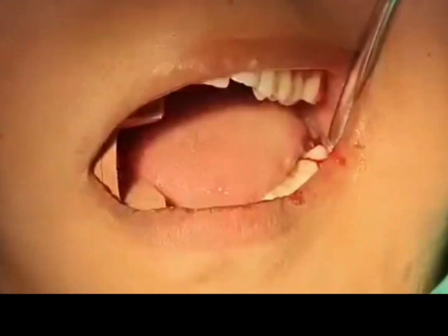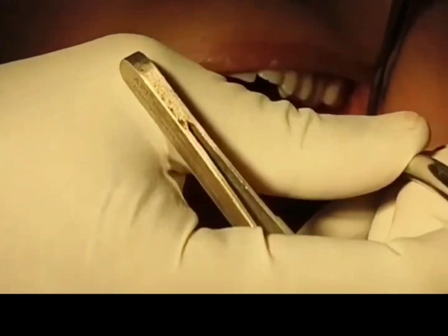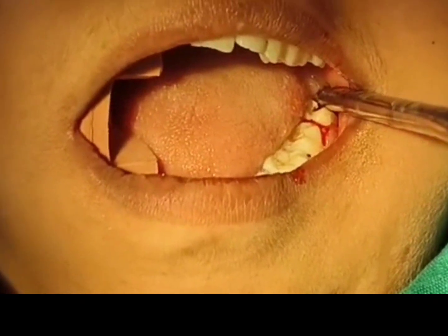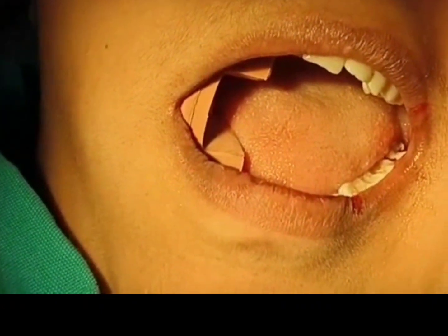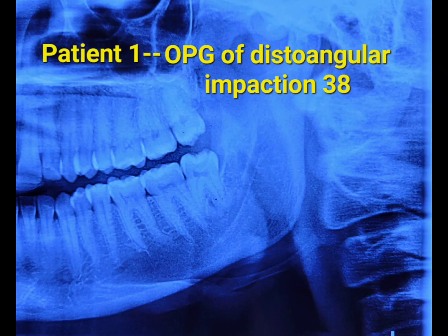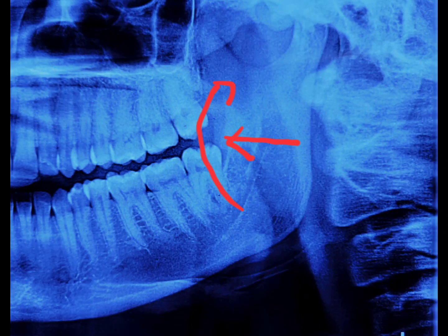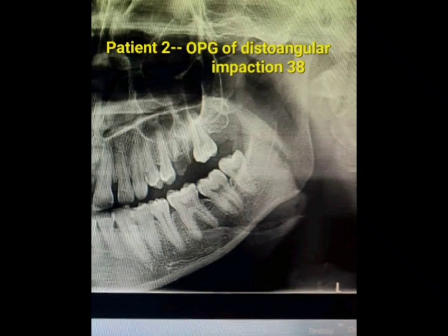Then, even after buccal bone groove preparation, adaptation of a straight elevator tip between second and third molar to distalize it is not simple, because there will be almost no space between crowns of these two molars at or just below the cervical regions. Many times we need to expand the lingual bone, placing the elevator buccally straight in the prepared groove and rotating the tooth distolingual to distobuccal. This step can fracture lingual bone, compelling its removal if it is too loose. It can lead to laceration of the soft tissues and even injury of the lingual nerve.